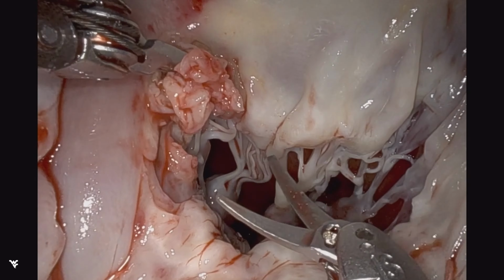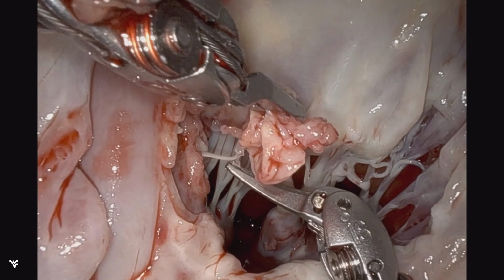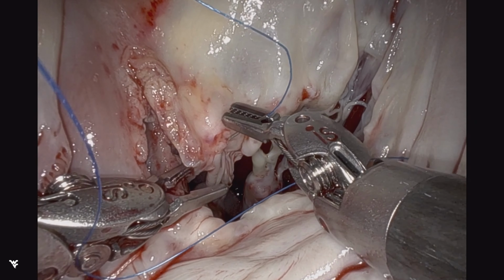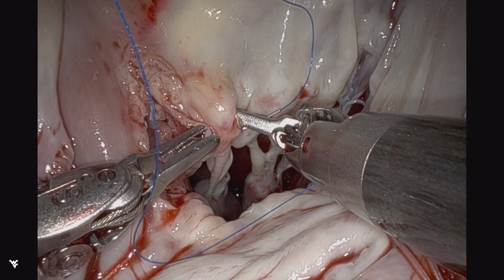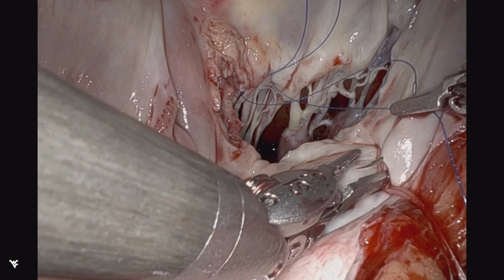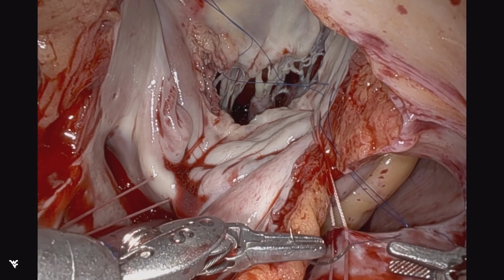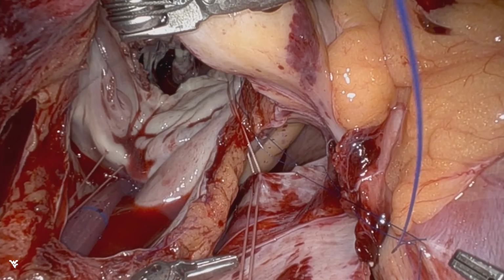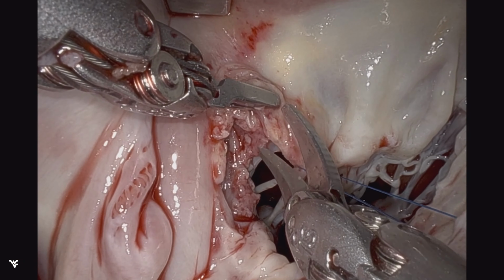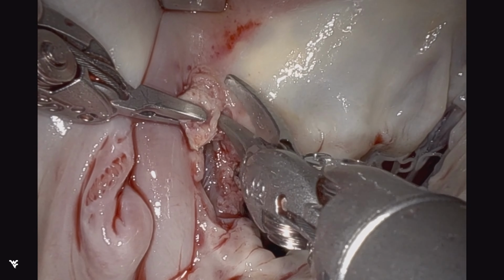And here we start to see an even more concerning vegetation that is involving the left ventricular outflow tract. To help with better exposure, this is a 5-0 polypropylene suture that helps with countertraction to retract the anterior leaflet, thus exposing the underside as well as some secondary cords.